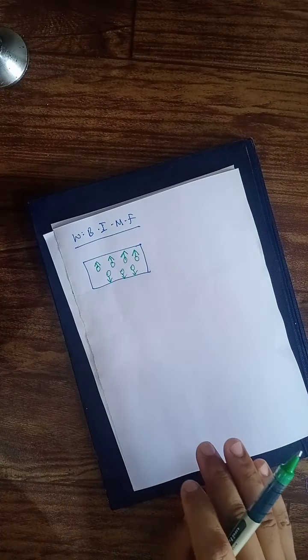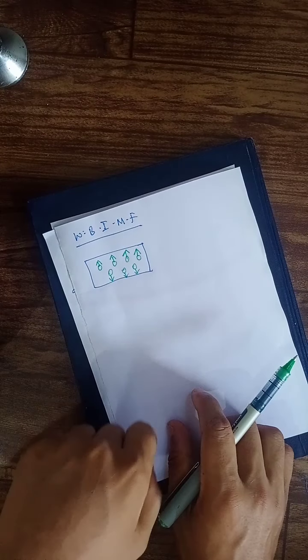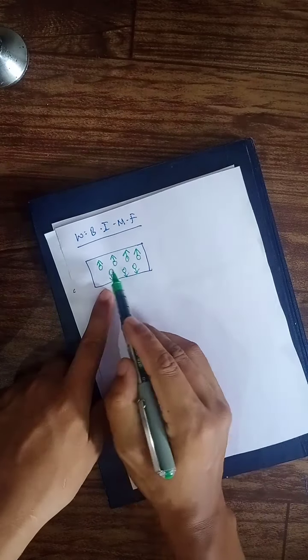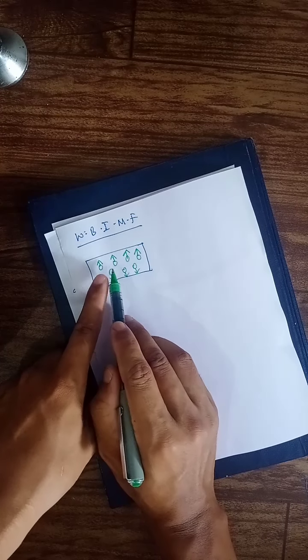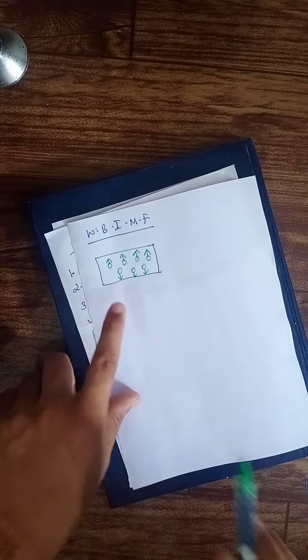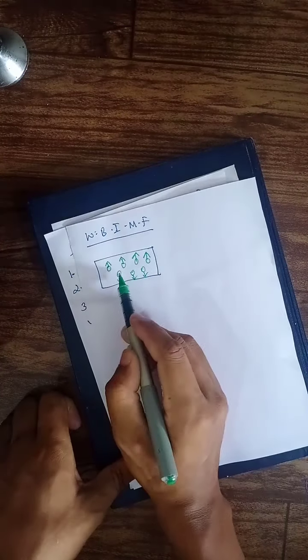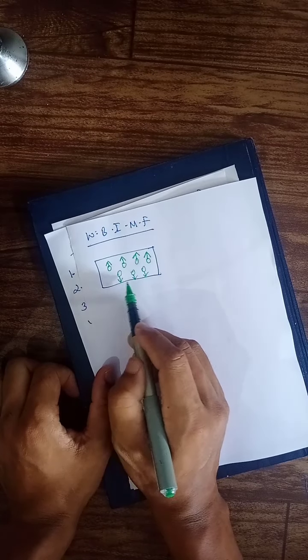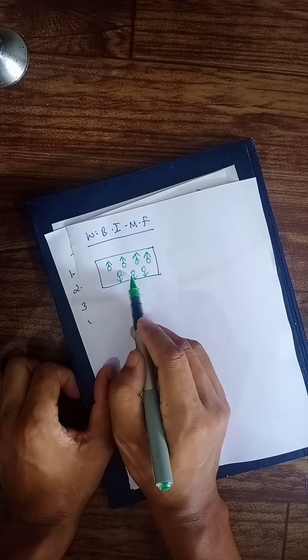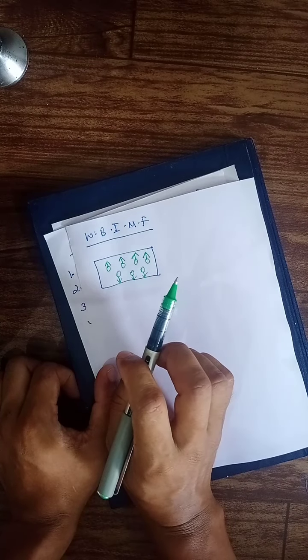You must have seen that. So this is what is happening now. See, random motion, now again aligned, parallel and anti-parallel. The majority is in the parallel direction because it doesn't require much energy, but the other requires much energy. That's why a very low number is directing towards the anti-parallel direction. Now fine.